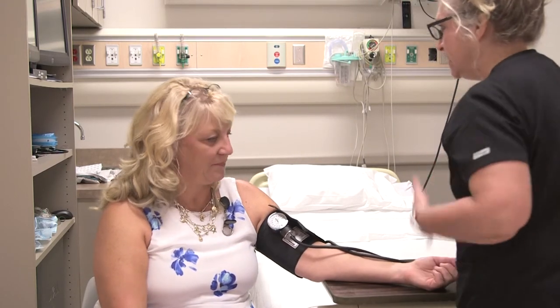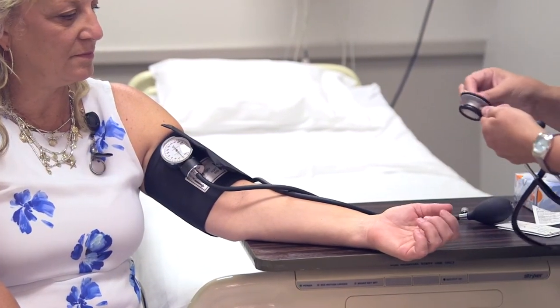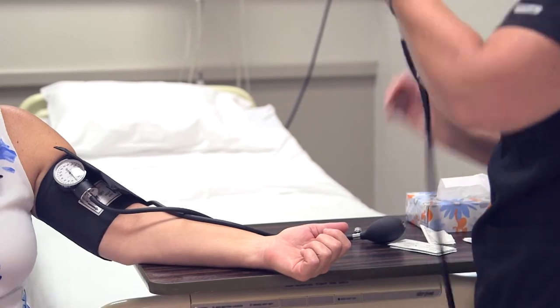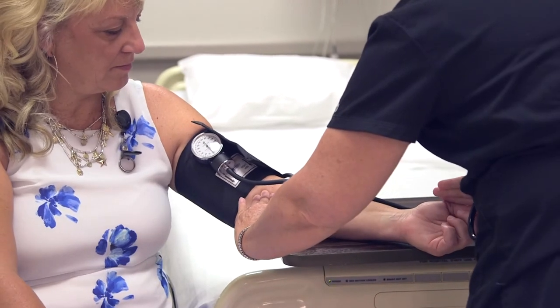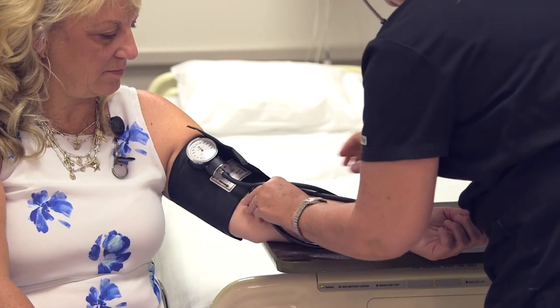So we'll pump it up. Now I just need my stethoscope. I'm going to go ahead and clean my stethoscope off here before I proceed. And I'm also going to feel your pulse up here so I know where to place the diaphragm of the stethoscope — it pulses right there.